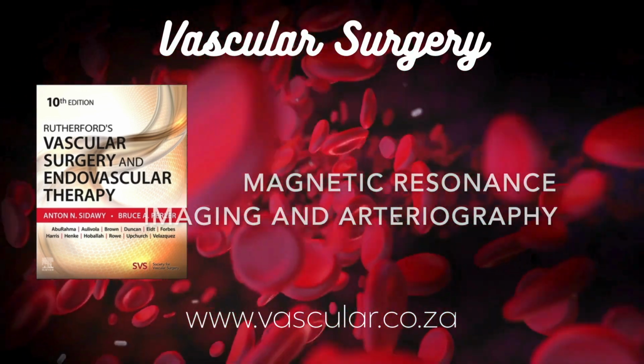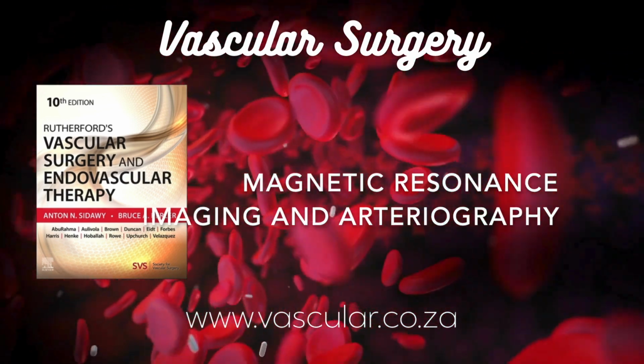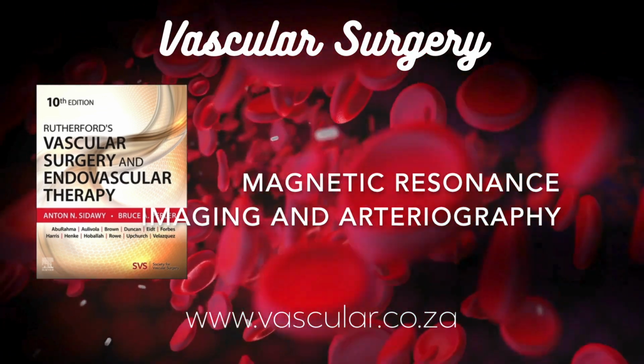While manufacturers sometimes suggest waiting a few weeks after placement for tissue to grow around the device, truly non-ferromagnetic devices can often be scanned immediately if needed. But they can still cause artifacts.